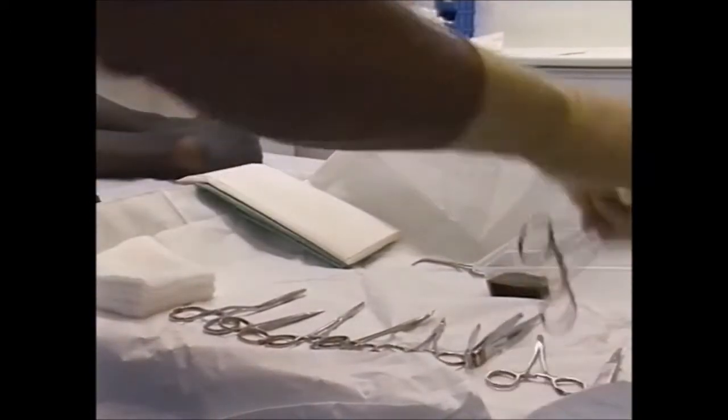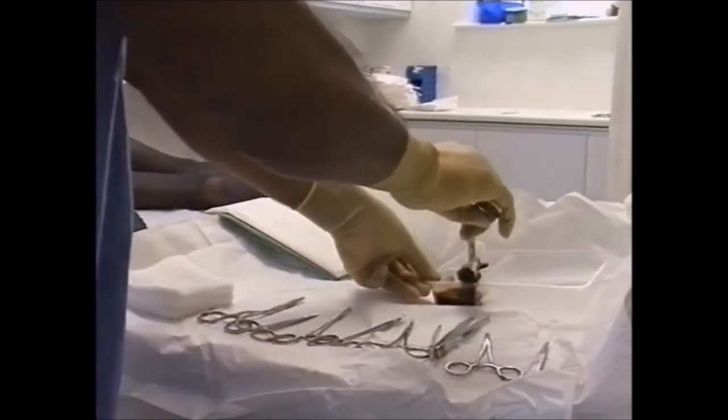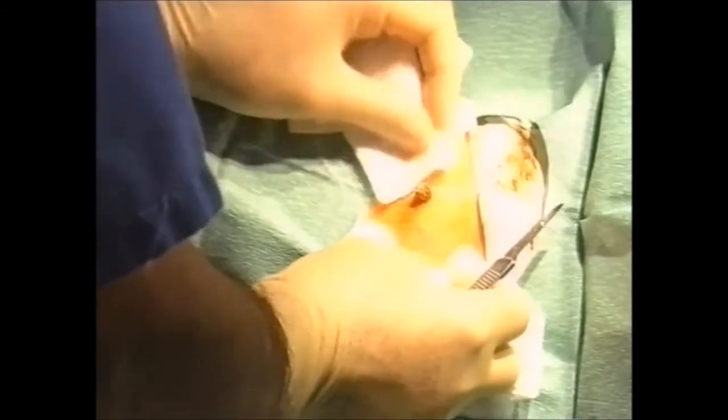Iodine is what I use most of the time for skin preparation, though you can also use chlorhexidine. It is useful to put a swab below the lesion so it doesn't mess your trolley or the floor.